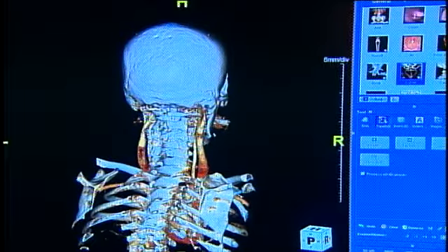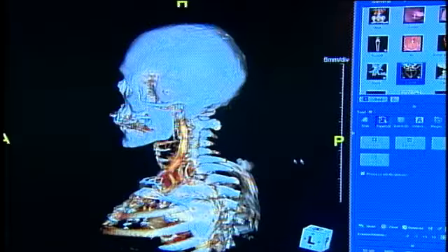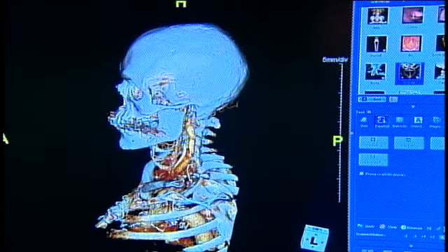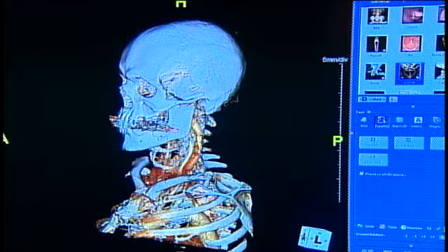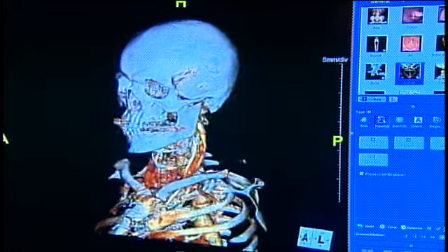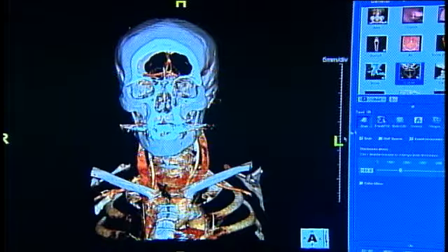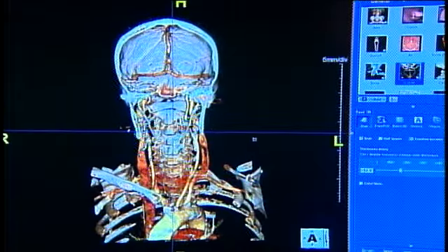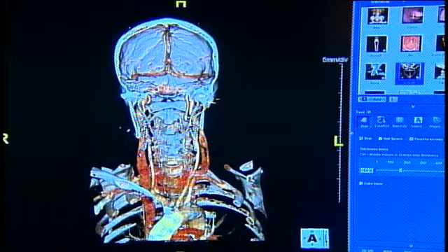These are your jugular veins coming down to drain the head. Over here, back here, are the carotid arteries going up into the head. This gives blood supply to the brain, so we're always looking at that to look for possible stroke. We can take this then and cut through, and now you can see these carotid arteries going up into the head.